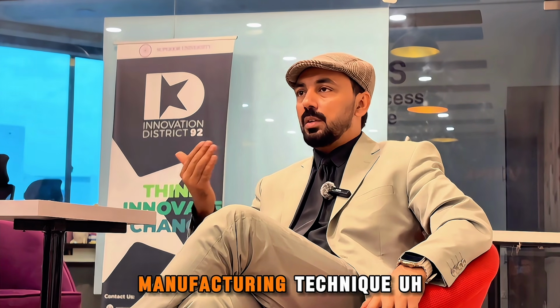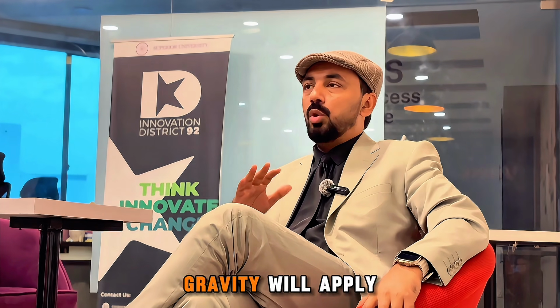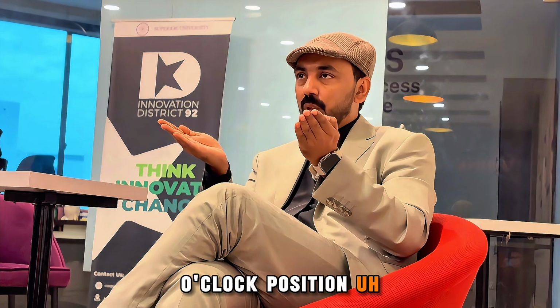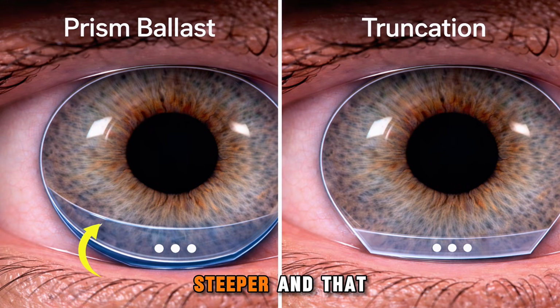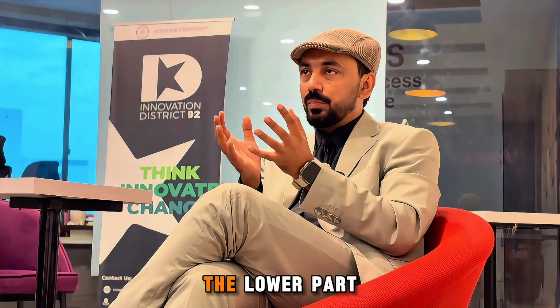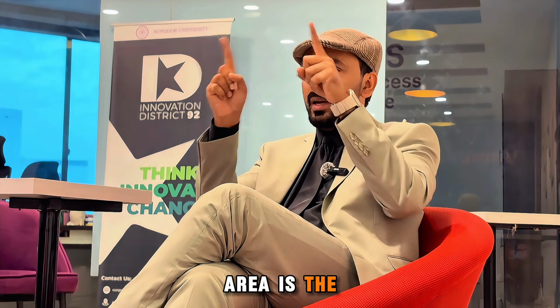And the third technique is called the truncation technique, the truncation manufacturing technique, in which no gravity will apply, no weight of the lens will apply. So how can we make a truncation in soft toric contact lenses? The lower part of the soft toric contact lens, the 6 o'clock position, will get flattened at that point. The rest of the lens will be steep fit, and that inferior area of the contact lens will be flatter, right? So the lower part is flatter and the upper area is the steep fit.